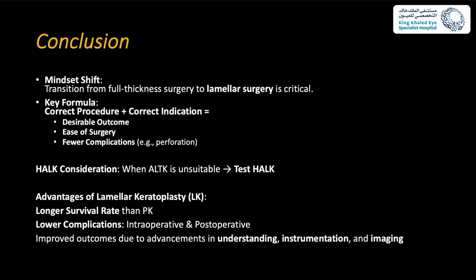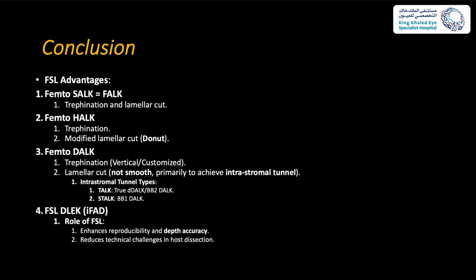The advantages of lamellar keratoplasty are a longer survival rate compared to PK, lower complications, and improved outcomes due to advancement in understanding, instrumentation, and imaging. Femtosecond laser can be helpful in DALK in trephination and lamellar cut, and in SALK in trephination and lamellar cut. In HALK it can help with trephination and a modified donut cut in case of scar.